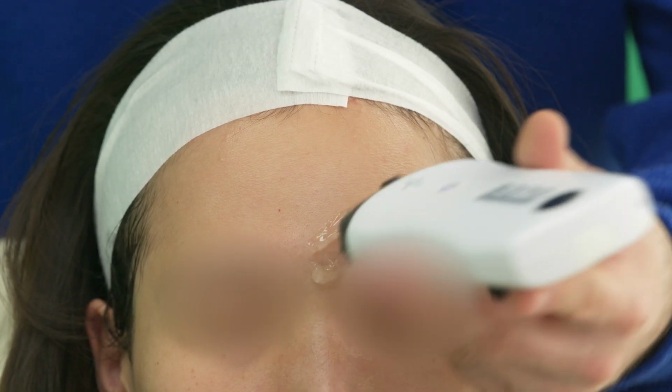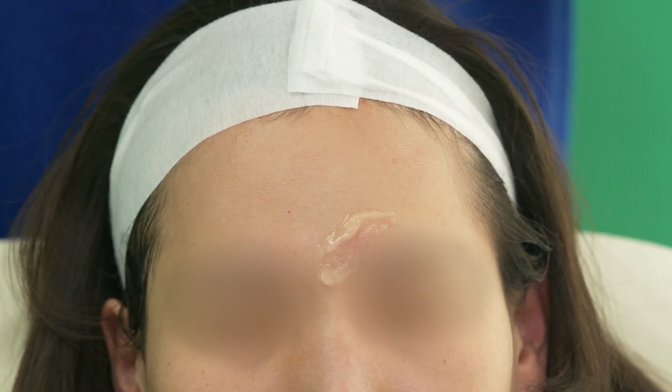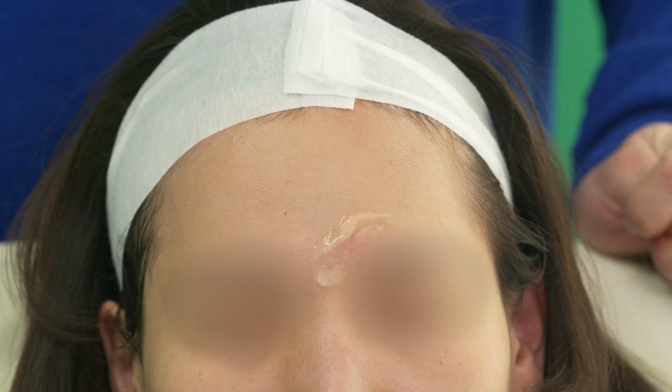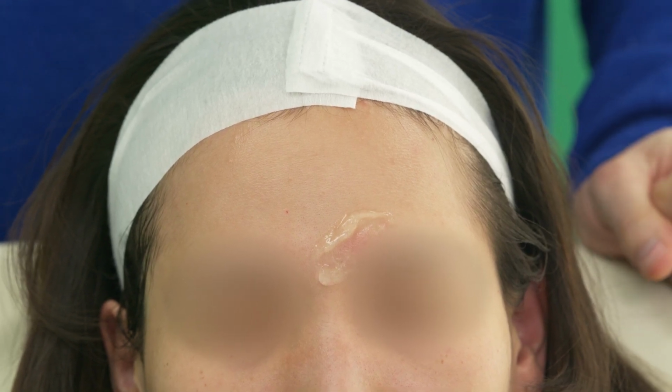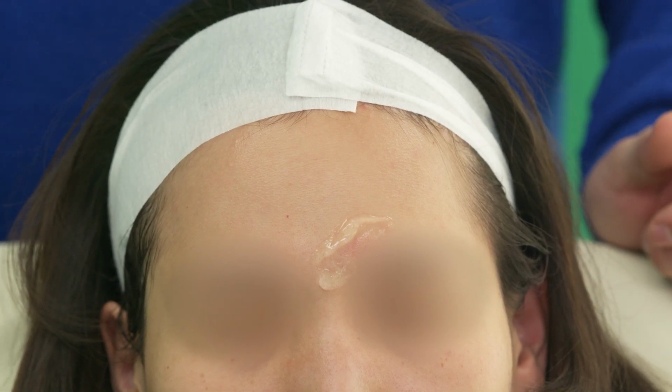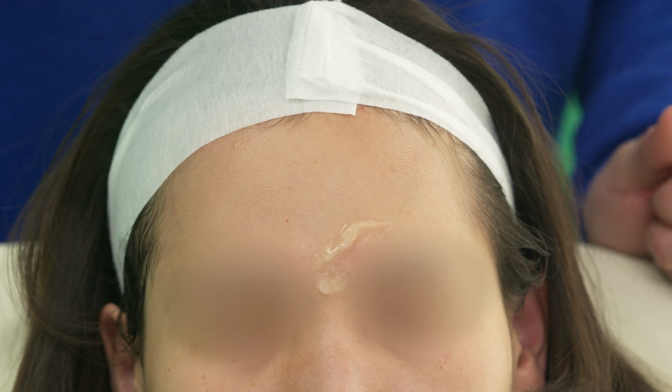The supratrochlear artery can be placed near or beneath the glabellar wrinkles, so you can ask your patient to frown and then examine the wrinkle area. For a safe and neat procedure, first check the location of the vessel and then decide the approach you will use for this region. With SONO-Finder, the best outcomes are in the palm of your hand.